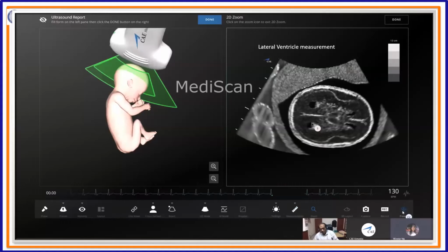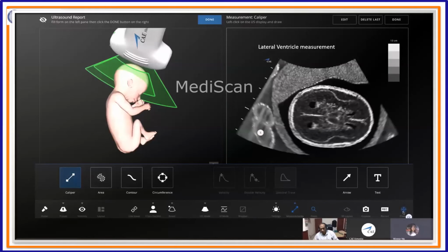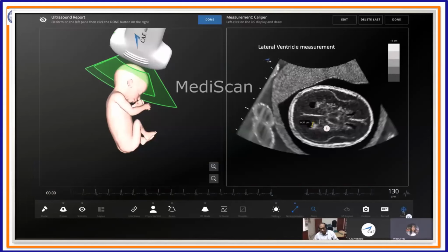So now I can see the lateral ventricle. So I'm going to take a measurement. I'm going to use the inner to inner measurement of the lateral ventricle at the level of the glomus of the choroid plexus. And at this point, you will also see the parieto-occipital sulcus.